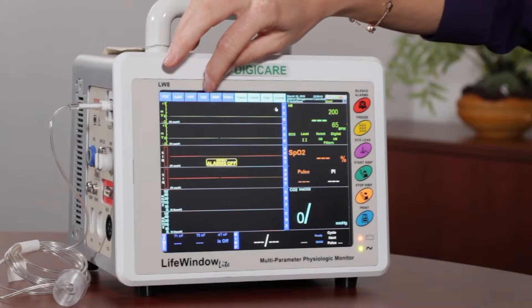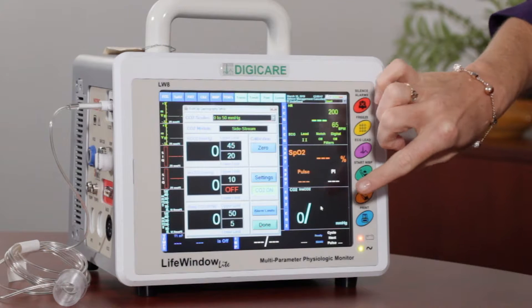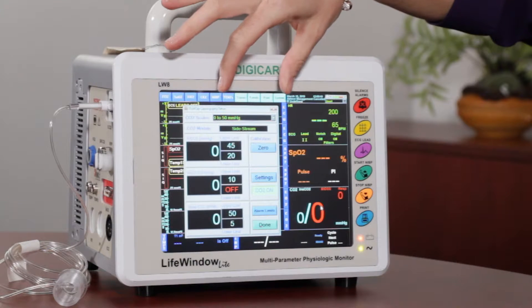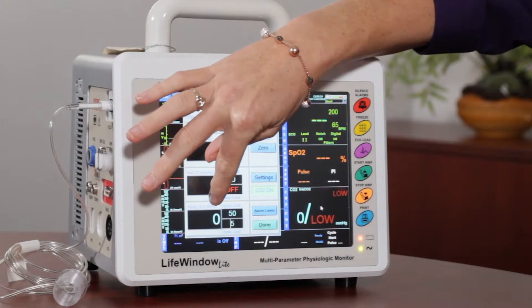To get to the CO2, you either hit the CO2 tab on the top or you hit the CO2 parameter itself. This is your CO2 setup. This is where you're going to see your end tidal CO2 reading, your inspired, and your respiratory reading.